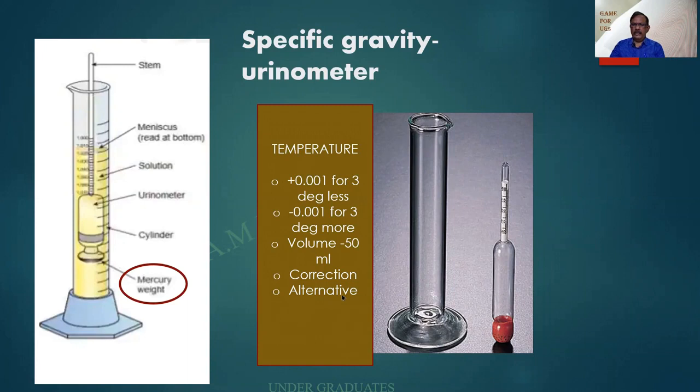And there are also alternate methods you people should be knowing. So there is a bulb over here, and then the neck with the graduations. This is a jar.